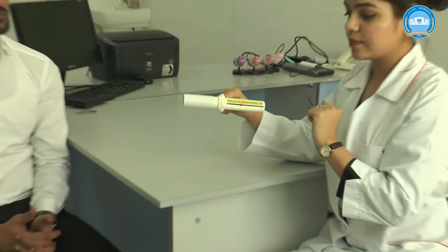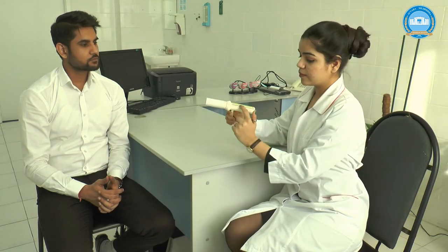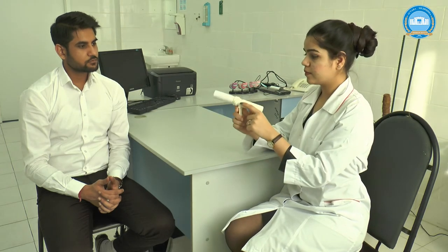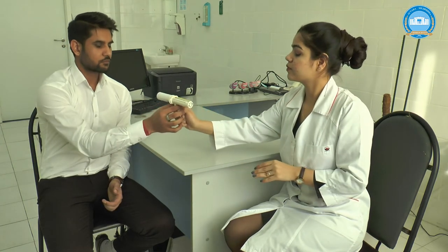The study is carried out in the standing or sitting position of the patient. Before starting the study, the pointer is brought to its original position at zero. Then we ask the patient to take a deep breath, holding the peak flowmeter horizontally, and after that we ask the patient to exhale with the highest possible speed into the peak flowmeter.